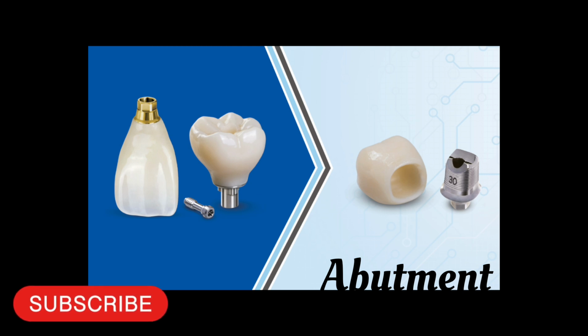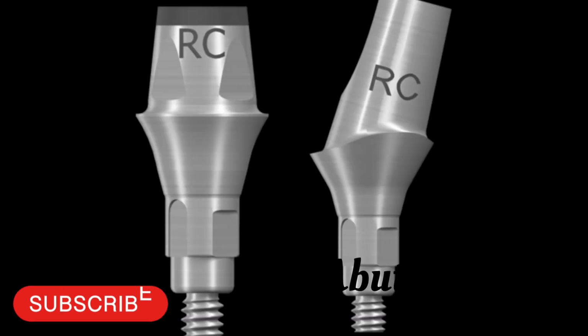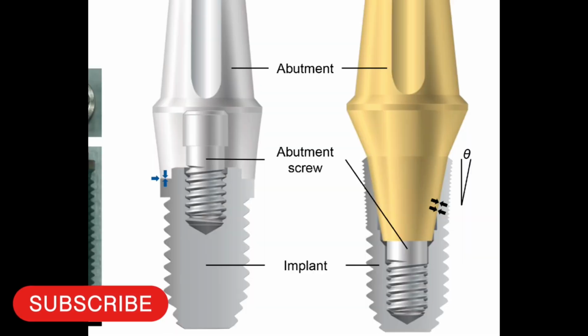First of all, an abutment used for screw retention on left side, then an abutment for cement retention, as you can see on right side, and the third type of abutment is the abutment that is used for any kind of attachment. Abutments are further classified into straight abutment or angled abutment. Straight abutment, as you can see on the left side, and angled abutment on the right side. Abutment can be fixed to the implant body with the help of an abutment screw.